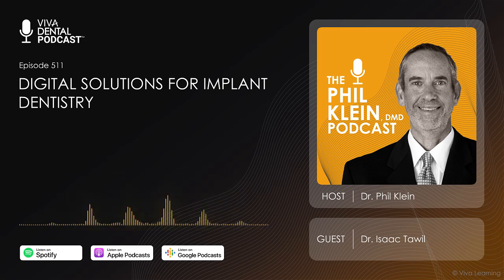The ability to scan metal is very, very important. Most of our patients presenting for implant therapy are going to have a lot of metal in their mouth, and we need that intraoral scan to merge it with the CBCT data so we can make a really accurate diagnosis, especially if we can use a surgical guide.